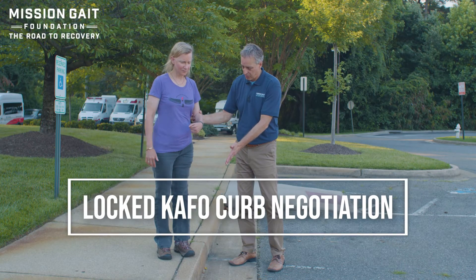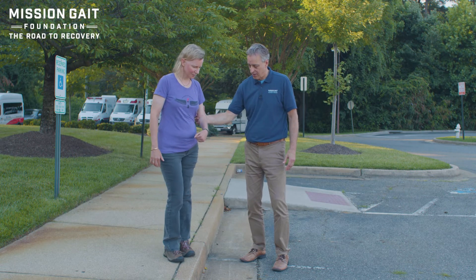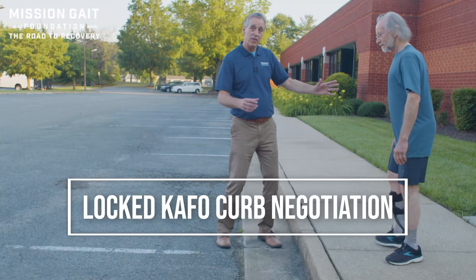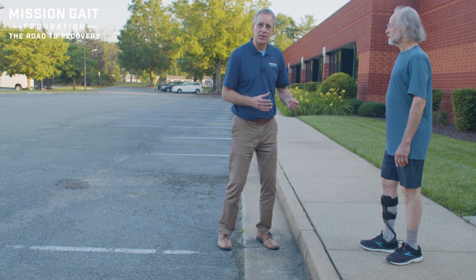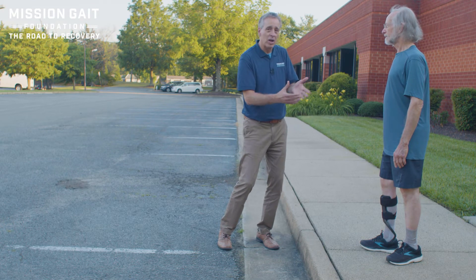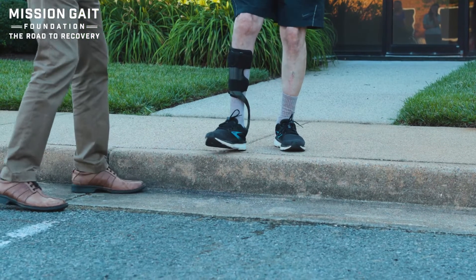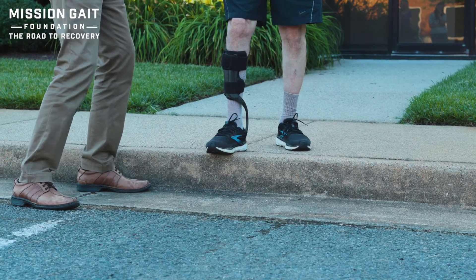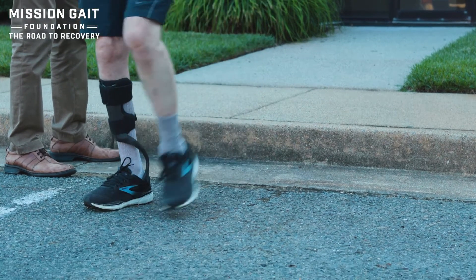Don't go all the way to a 90-degree angle — just a 45. So step off sideways with your left foot, pressure down and then step away. If the patient is strong and wants to — for a number of reasons, because of involvement in the other leg — and really decides that the side with the brace is my stronger leg and I want to lower with that leg, then come down leading with that foot, hanging that foot a little off the edge. Clear the toes so that ankle will bend enough to step, and then step off and just ride off the front of the orthotic.